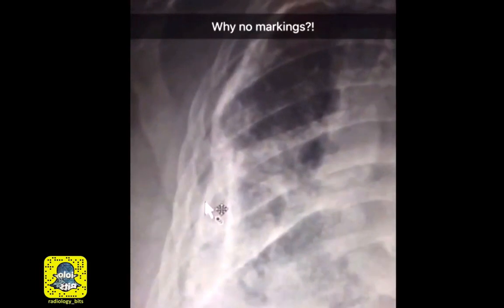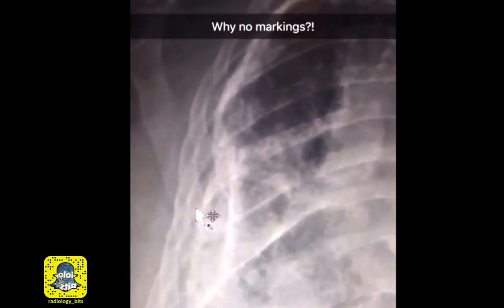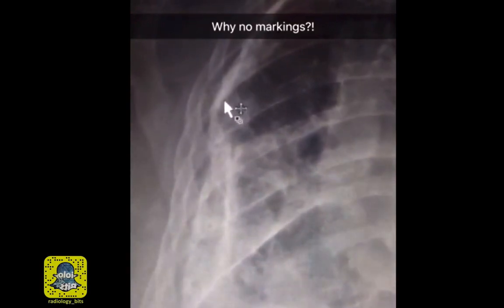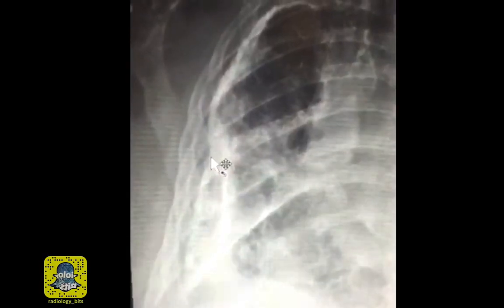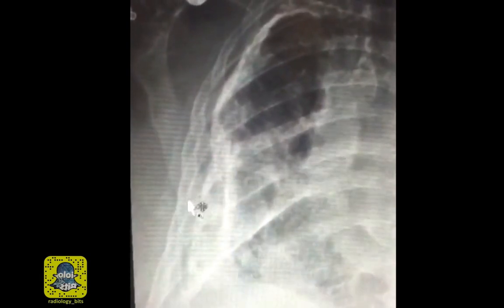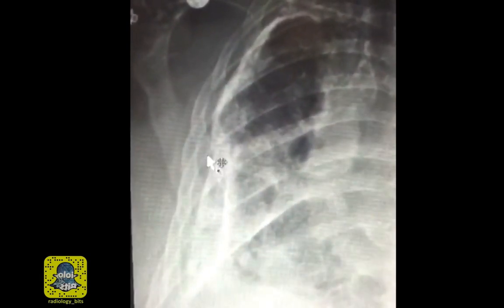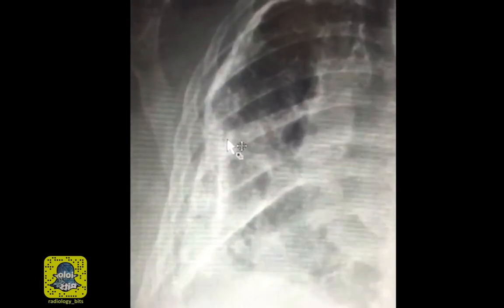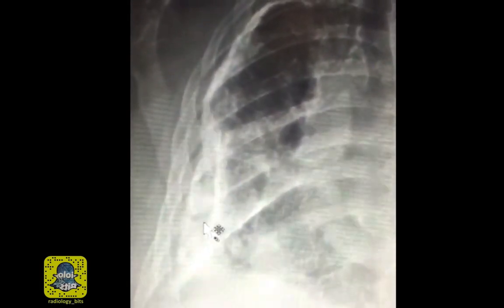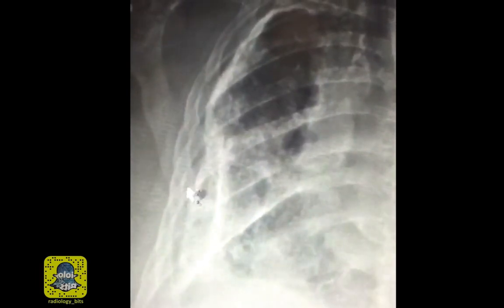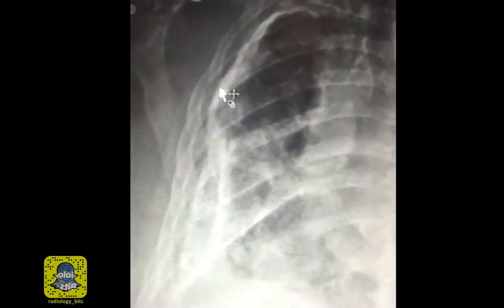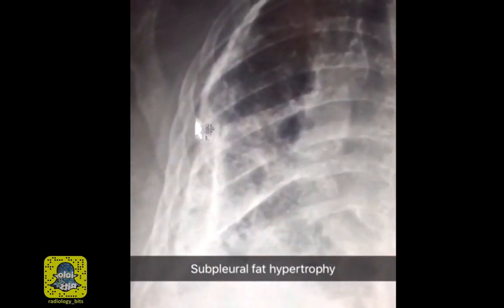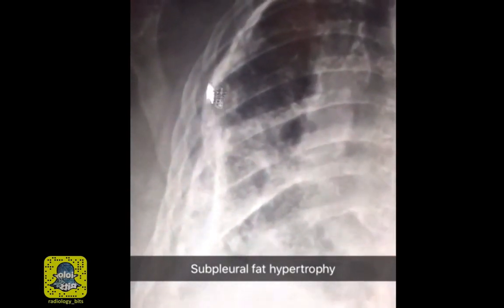The next point is very interesting to show seniors — how to explain this lack of lung markings beyond that pleural thickening. When talking about calcific fibrothorax, the reason is not clearly explained in textbooks, and that's why I'm showing this. When you have chronic volume loss, the subpleural fat tries to compensate for that space. So this dead space here is filled with subpleural fat hypertrophy.